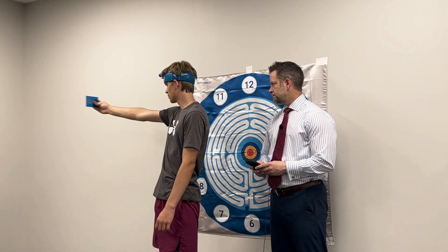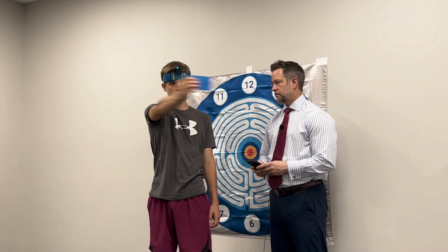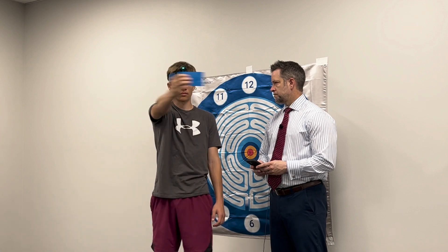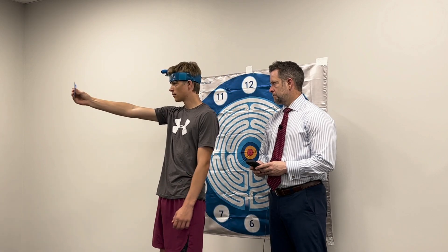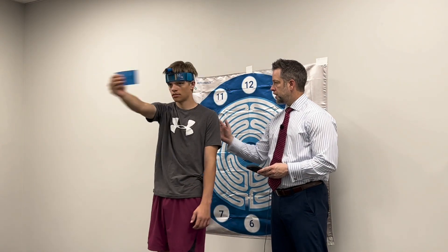Try to go through a larger arc, so move a little quicker. And stop.